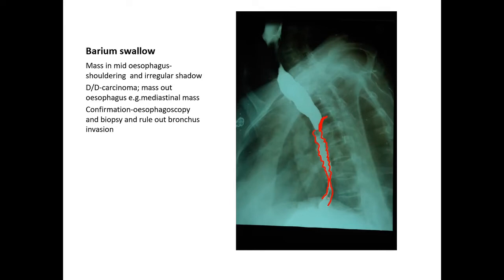It is after the barium swallow we now saw an esophageal stricture, because initially we were managing him for bronchogenic carcinoma.